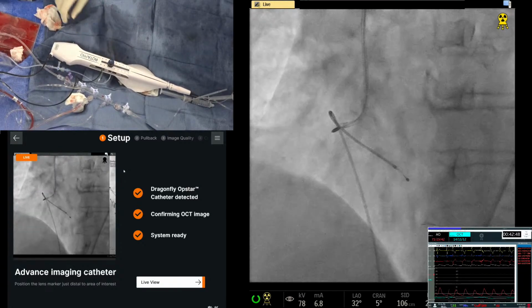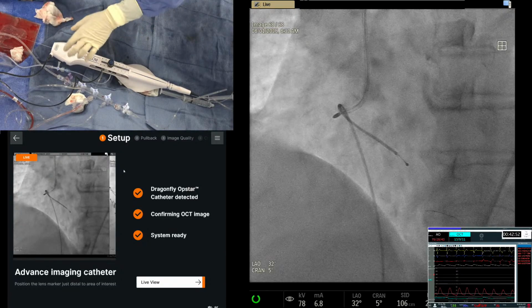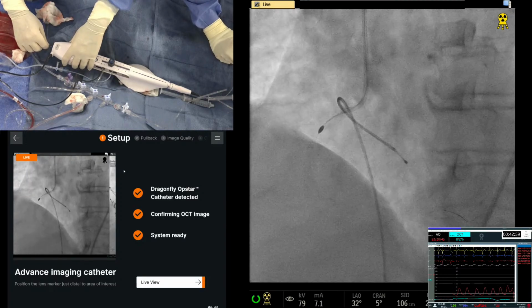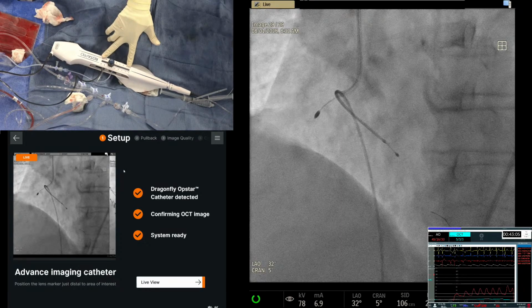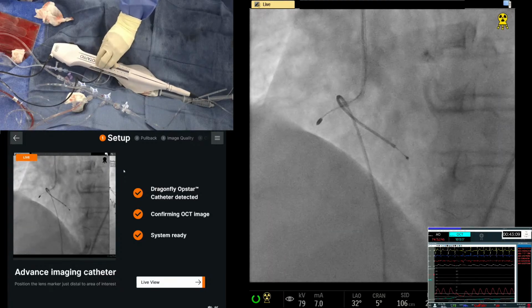Okay. So this is another thing that we want to teach. On Dynaglide, you see that? He's going to do the brake release and I'm going to move the burr forward. Good. Okay, stop. So now I get enough purchase, because this is only 9 centimeters here. And it's important that it's locked while you do that. Yes.